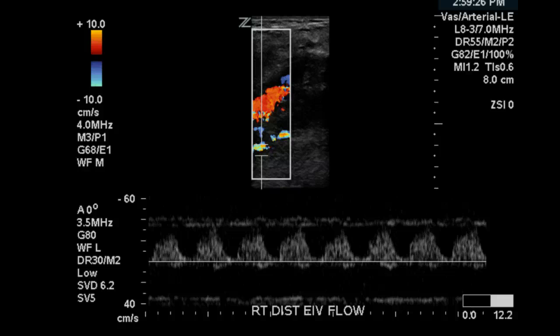Therefore, we can say there is a PSA, and that this person will likely need to be rescanned to determine if there is truly a deep vein thrombosis, or simply high pressures that would not allow the sonographer to compress the veins that we saw in the right common femoral and femoral vein proximally.